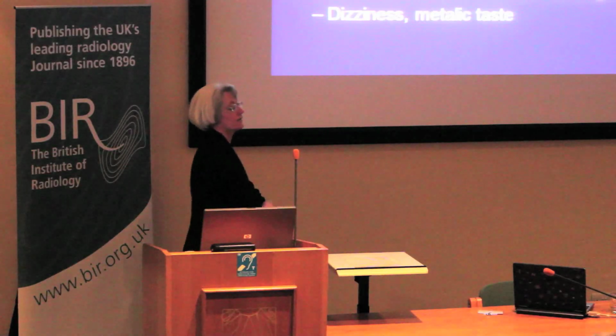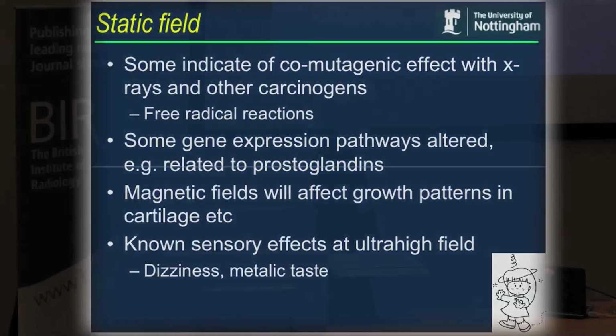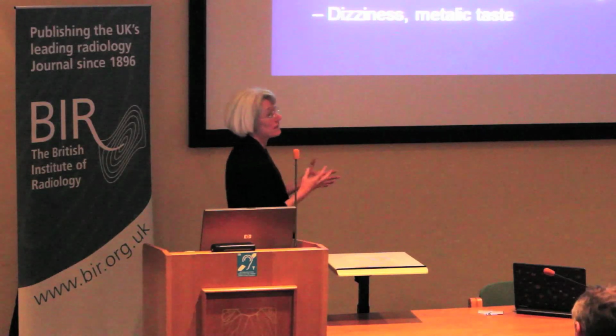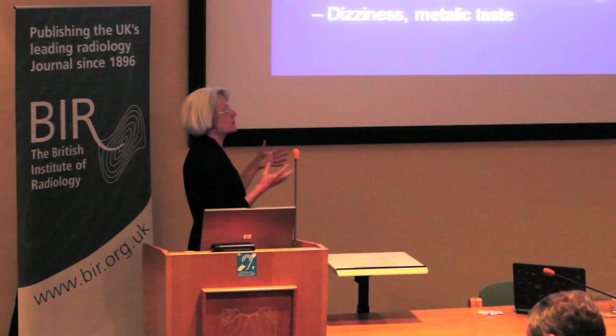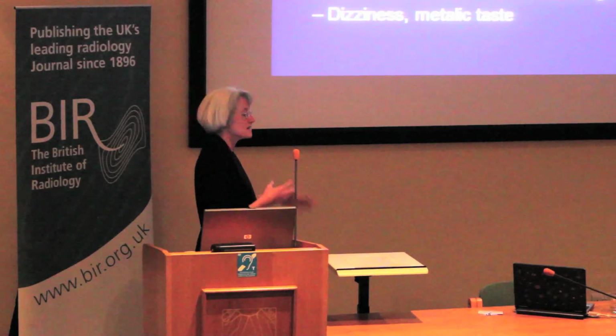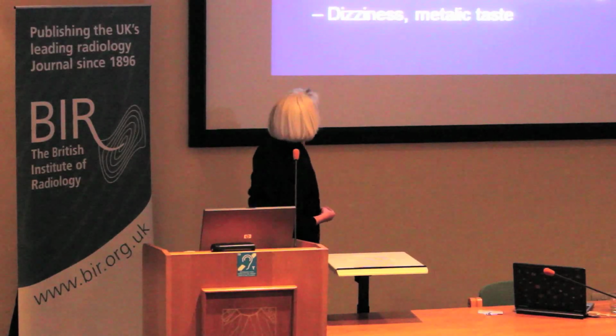Now, these effects do have potential biological effects. There is indication that chemical reaction rates, well, it's definitely the case that some chemical reaction rates can be affected by magnetic fields because basically of the spin states of the electrons. And you might think, well, that's a bad thing for biology, but actually when you put that into a biological context and you look at it in a biochemical pathway, actually it's never the rate-limiting effect. Well, nobody's discovered it to be the rate-limiting effect.